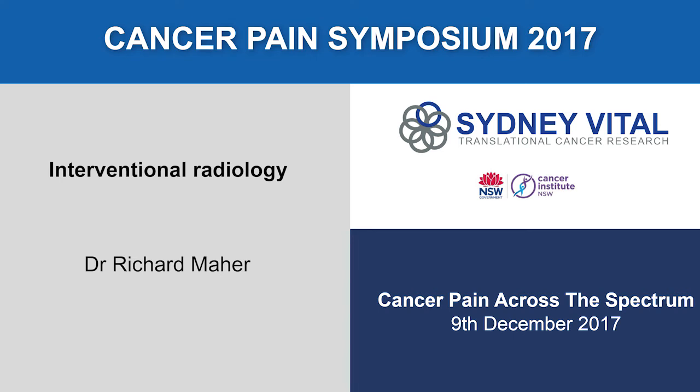Thermal damage to surrounding structures we mentioned, and very rarely it can weaken bone and lead to fracture. But in those situations you might think of combining it with augmentation, which is basically injecting some cement into that lesion to give that stability back. All right, that leads us on to our third area, the vertebral and bone augmentation.